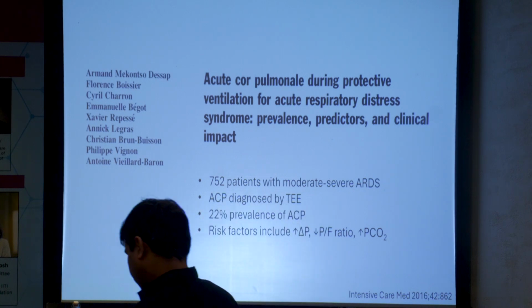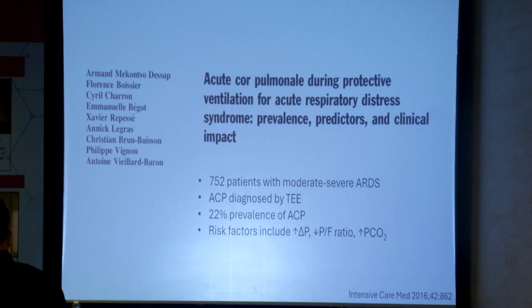I mean, usually if there are problems with thrombosis, it's more commonly in the oxygenator, even if you are not using any anticoagulation. Yeah, it's a much more common problem in the oxygenator than in the cannulas themselves.